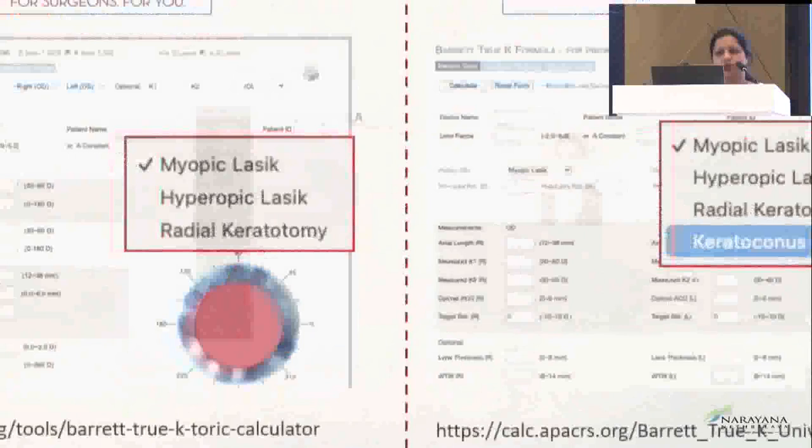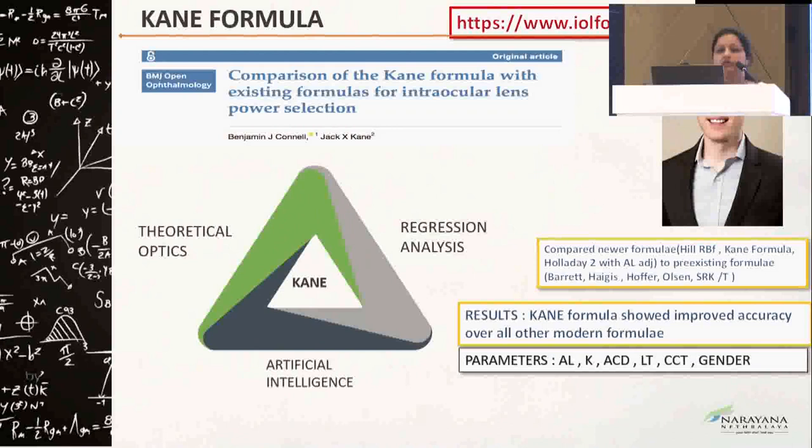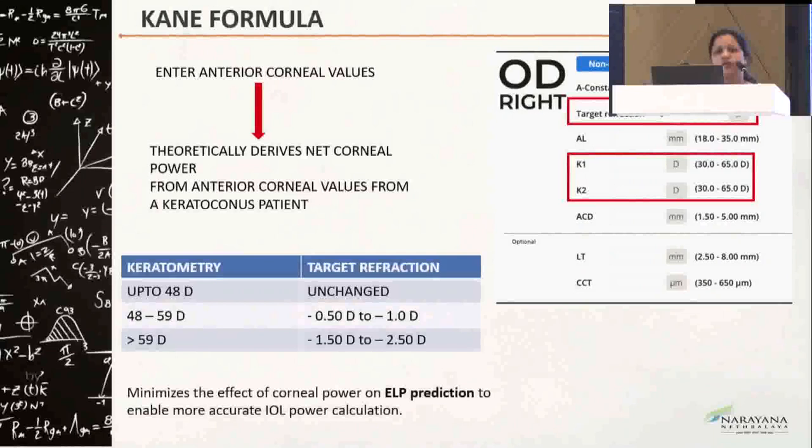Coming to the Kane formula, a lot of studies have shown that it is more accurate than all other modern formulas. It is based on a regression analysis of large data sets, artificial intelligence and theoretical optics, and uses even the CCT and the gender for IOL calculation. The difference between the Kane formula and the Kane keratoconus formula is that in Kane keratoconus, he uses the anterior corneal radii of curvature to derive a modified corneal power. We have to enter the anterior corneal values, and it theoretically derives the net corneal power.